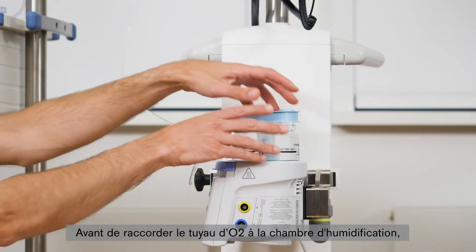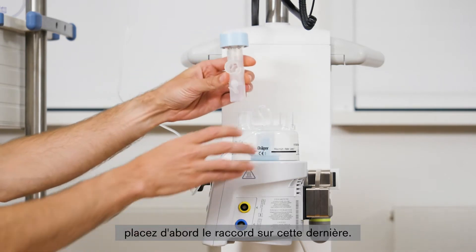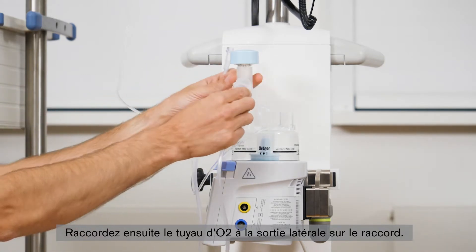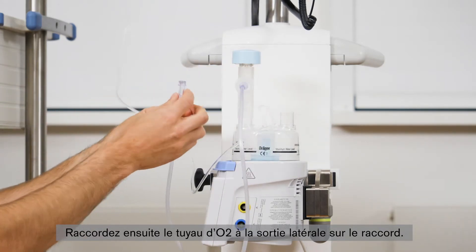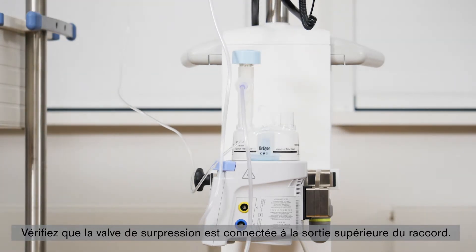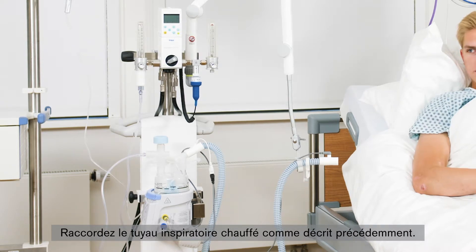Before connecting the O2 hose to the water chamber opening, attach the connector to the water chamber opening. Then connect the O2 hose to the lateral opening of the connector. Ensure that the pressure relief valve is fitted to the upper outlet on the connector. Connect the heated inspiratory hose as described above.